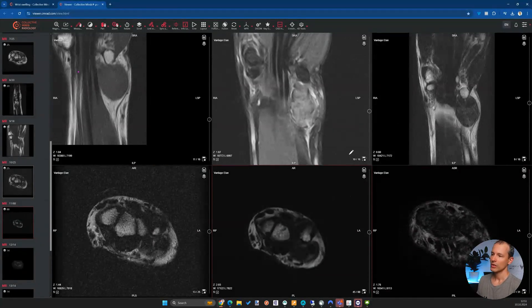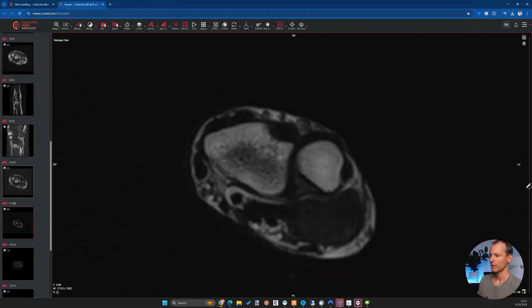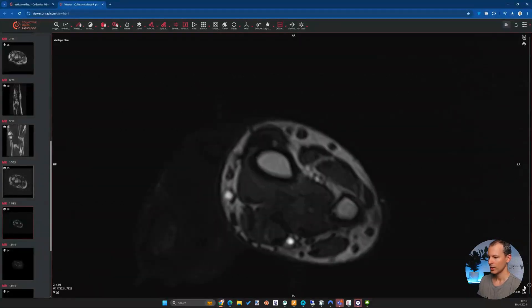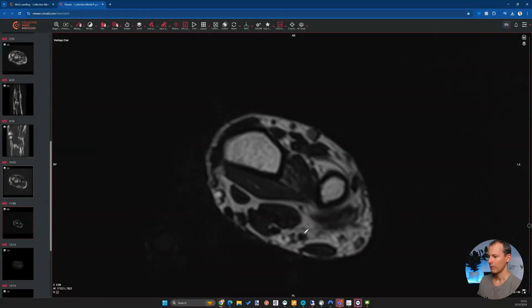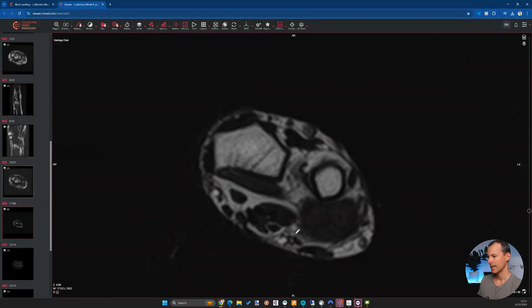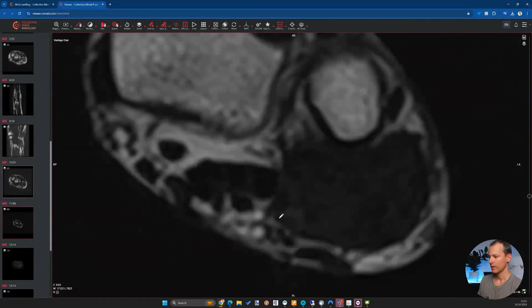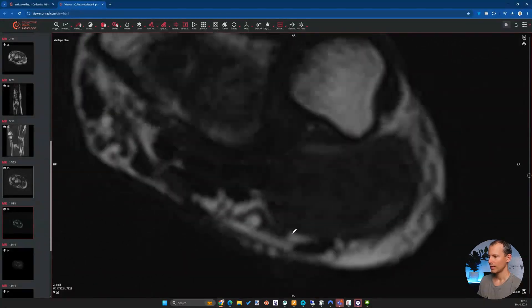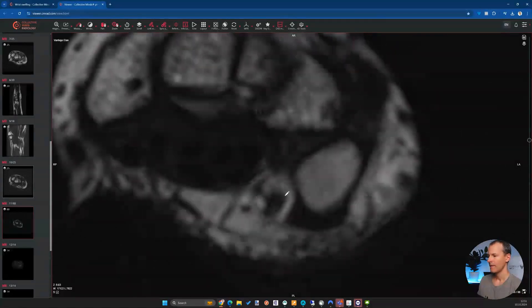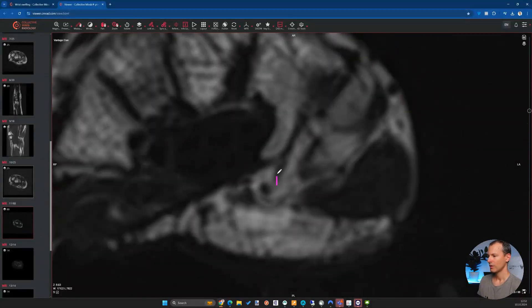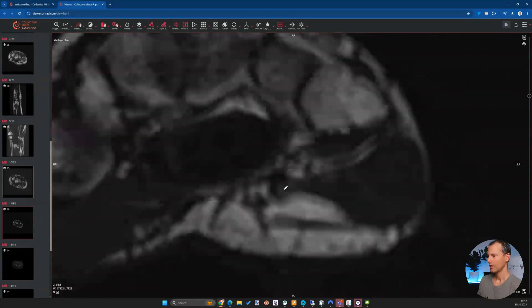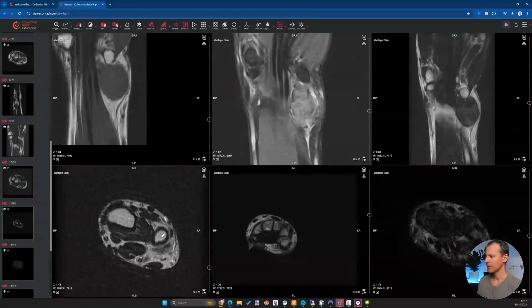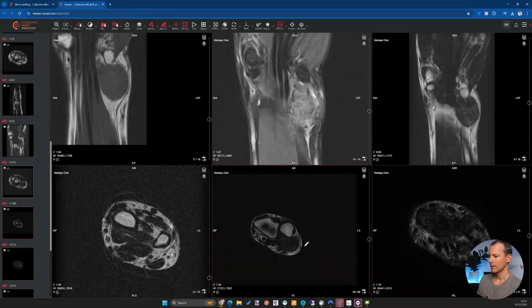We need to know which structures are close to the mass, and for that we have a 3D sequence. We can see the ulnar nerve here — we want to make sure we're not looking at a nerve sheath tumor. Following the nerve, it gets displaced by the mass and is separated by a fat layer in most areas, though in some areas it has contact with the nerve, which is relevant for surgery. We can see the deep ulnar branch and superficial branches, but the mass is certainly not the origin of the nerve.